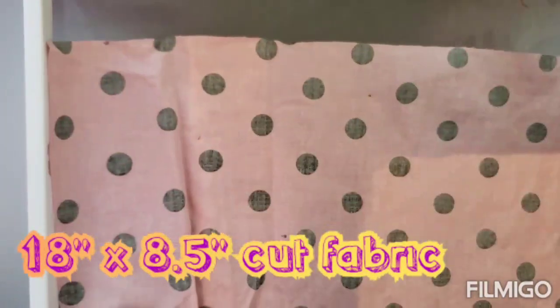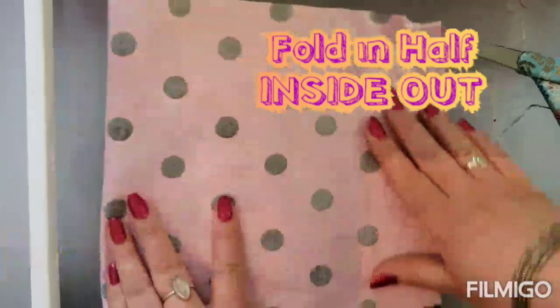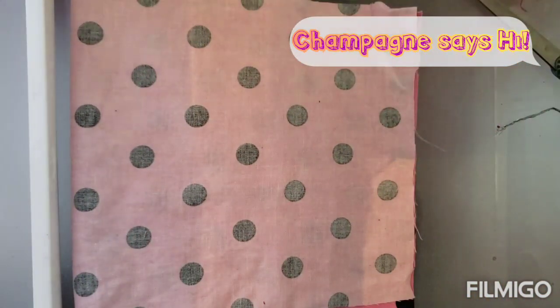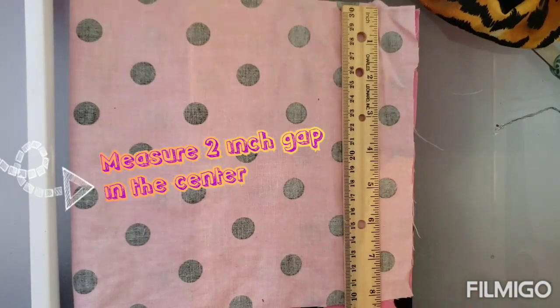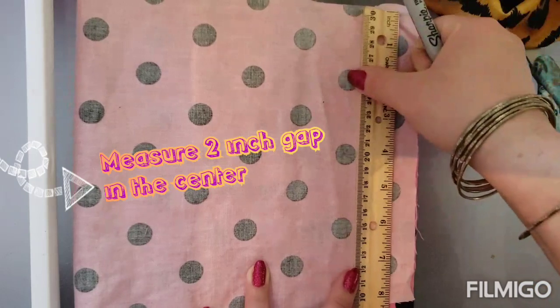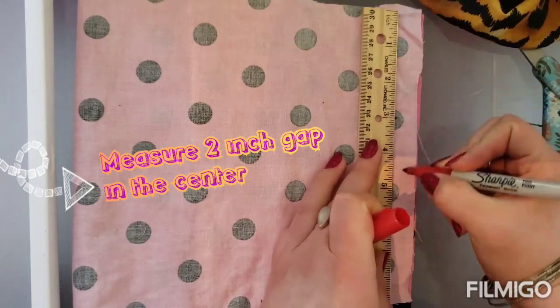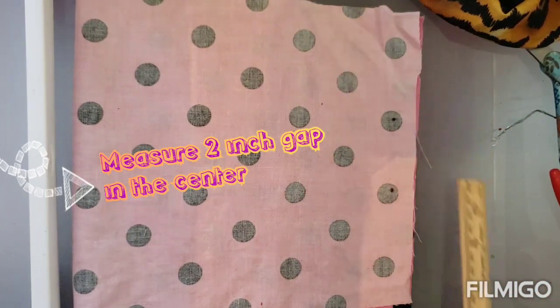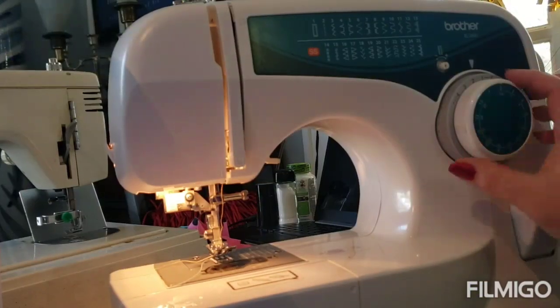For the main fabric piece, take your 18-inch piece inside out and fold it into a nice square. Measure to about eight and a half inches — a little smaller or bigger is okay — and you want a two-inch gap in the center of it. Mark that with your sharpie so you know when to stop sewing.